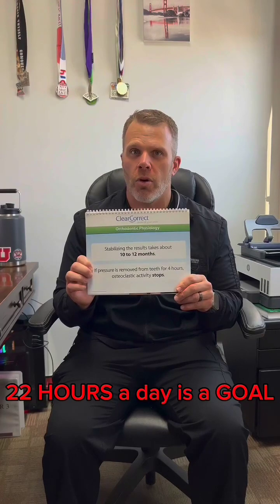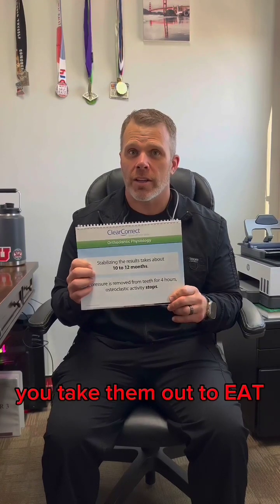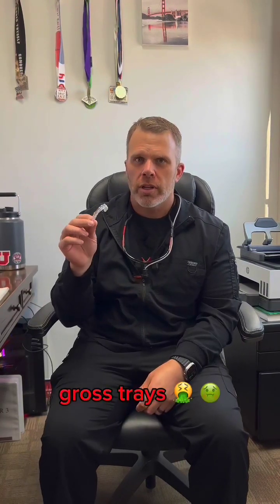So that's why it's so important to wear them 22 hours a day is the goal. You just take them out to eat, brush, rinse out if you're out at lunch, and put them back in. So that's important for you to get your smile. I know there's a lot of companies out there saying you can just wear them at night. That is not true. That is a lie, because our physiology says we have to have the bone move, and that takes time.